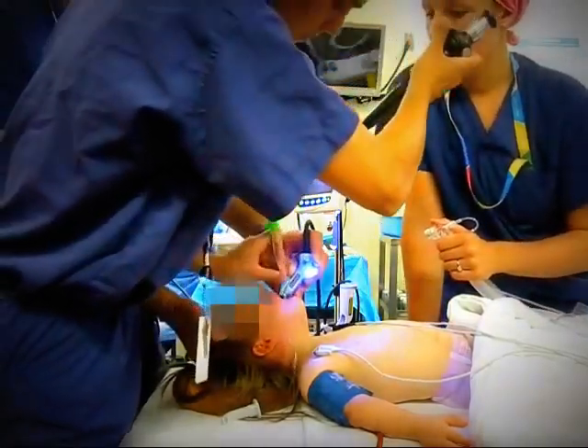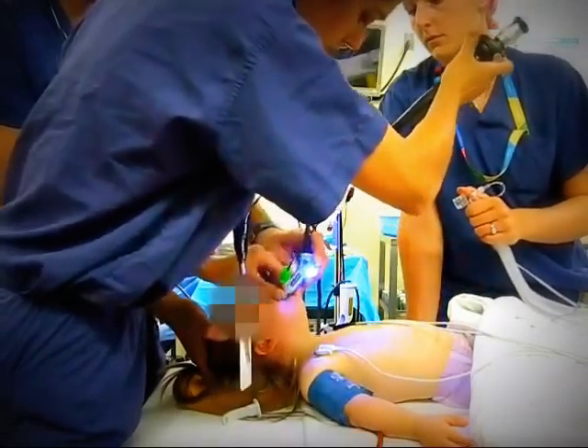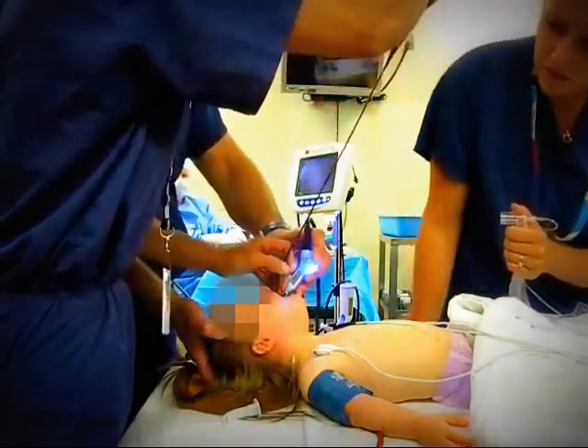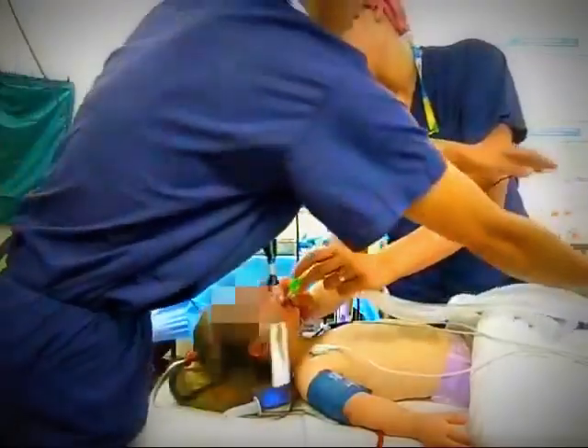Sometimes a twirling action is required in order to pass the endotracheal tube through the cords and into the trachea. At that point, the fiber optic scope is removed, as is the video laryngoscope blade, and oxygen tubing is hooked up.